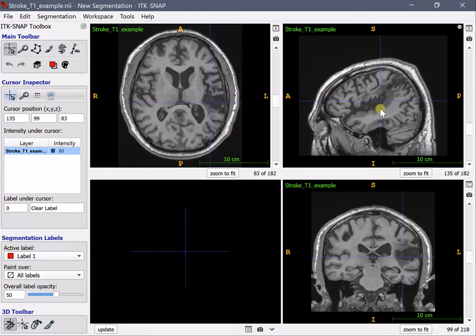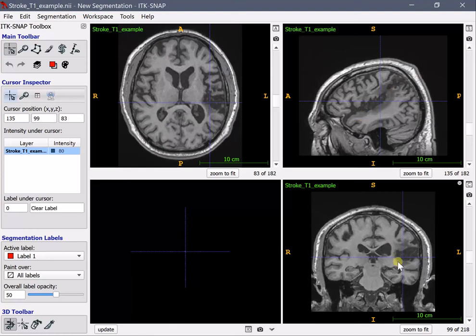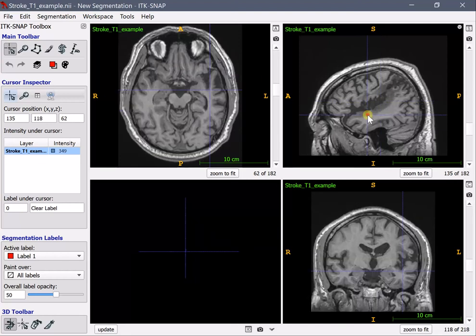In sagittal view this is part of the lesion. In coronal view you know that the lesion should be here and this is in axial view.